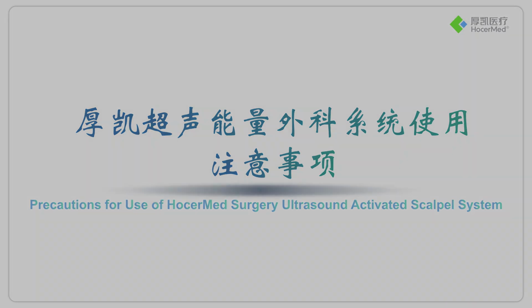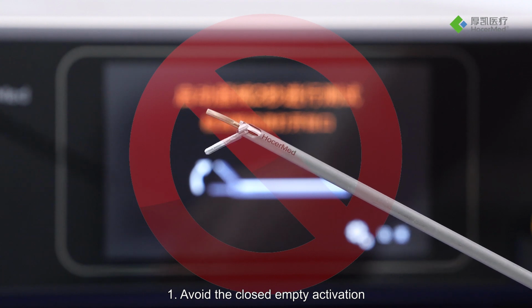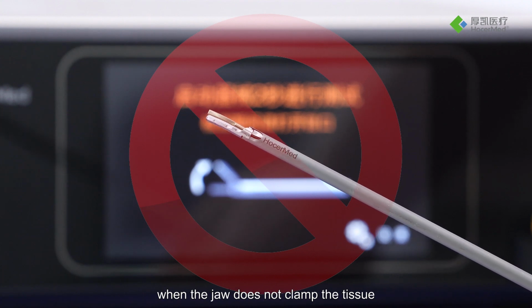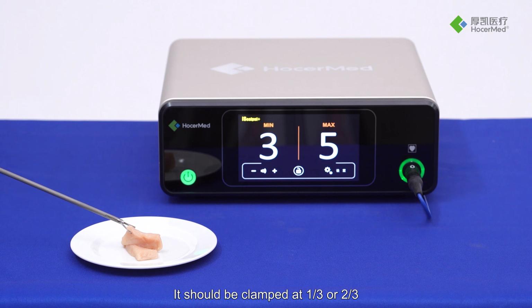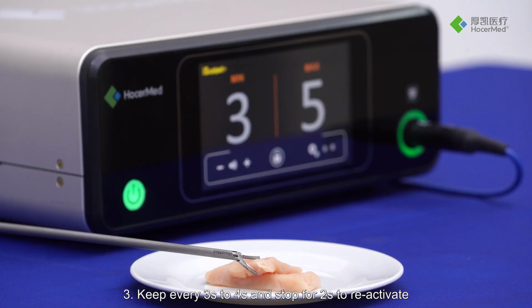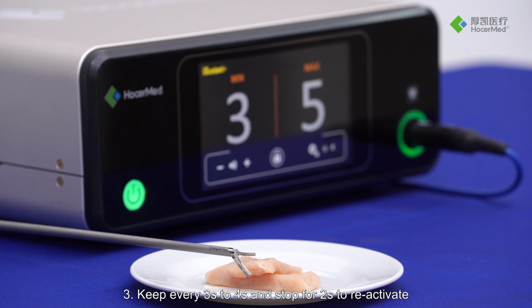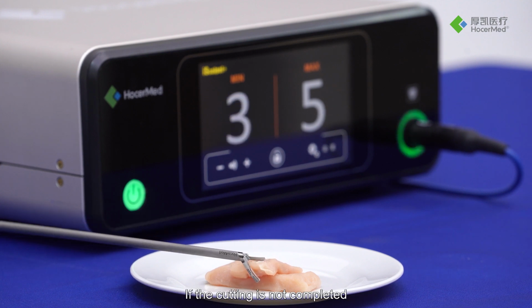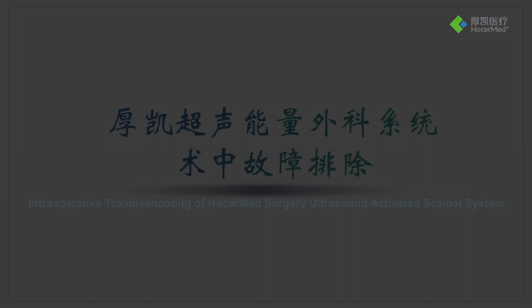Precautions. 1. Avoid the closed empty activation when the jaw does not clamp the tissue. 2. Avoid clamping all tissues in the jaw. It should be clamped at 1/3 or 2/3 of the front of the jaw before the next step. 3. Keep every 3 to 4 seconds and stop for 2 seconds to reactivate. If cutting is not completed, the maximum activation should not exceed 6 seconds.